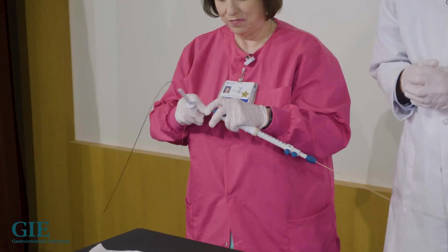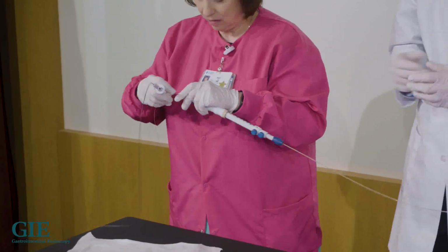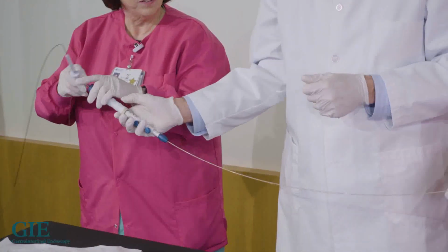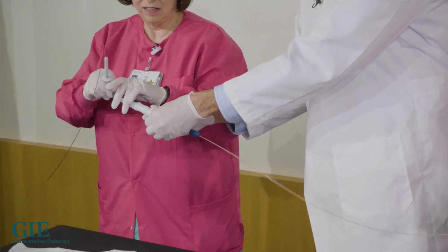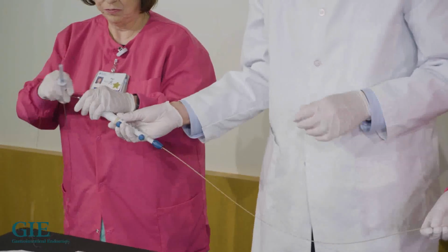Okay, now we're going to put the through-the-needle forceps through the EUS-FNA needle. Before you do this, once again, our needle is out. Remember, we're punctured into the cyst. And if you want to lock it so it doesn't go farther, you can lock it once again on your EUS-FNA needle so the needle doesn't go any farther as they're moving the forceps through.